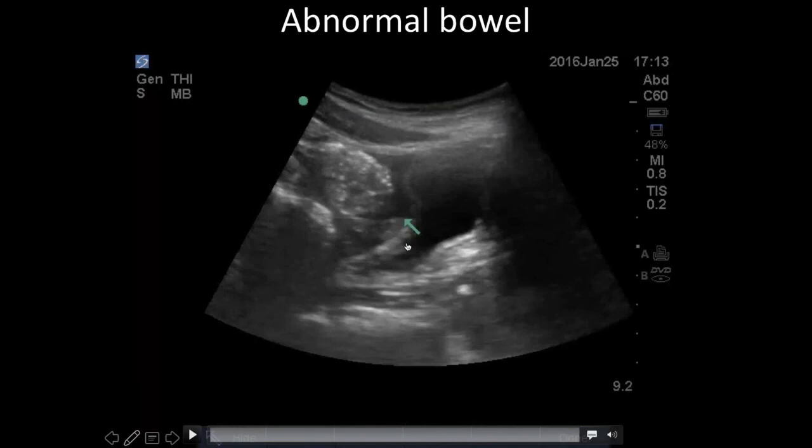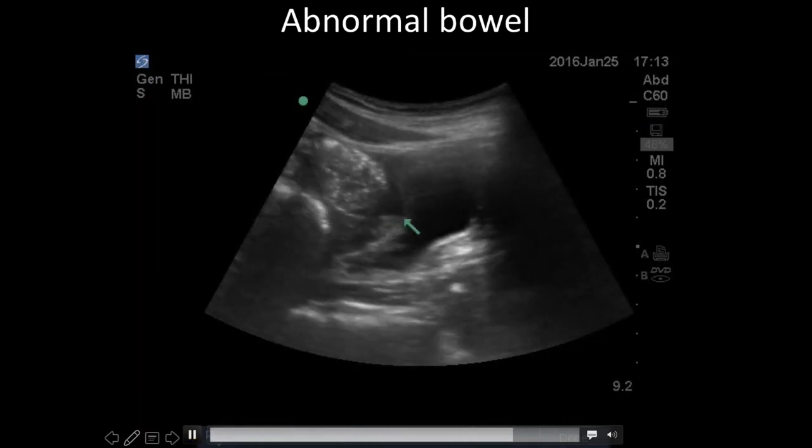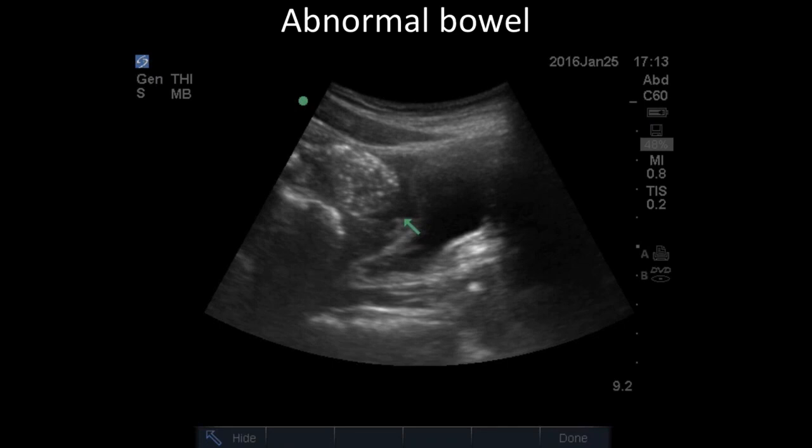And then you go into the sagittal view, and so you see the bladder here. This is the bladder in sagittal view. This is the pubic symphysis coming with some shadowing down there. And this is bowel here, but right around it, adjacent to both bladder and bowel, is this area of free fluid. So you can see the pointy edges right there, and then this side is kind of outlining the bladder. So the arrow is really pointing to that free fluid. So you've got dilated loop of bowel with some free fluid in a patient in pain.